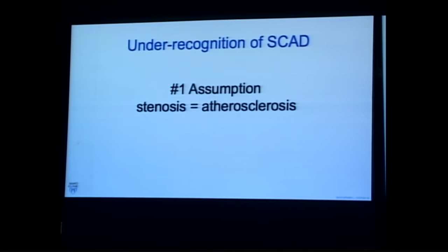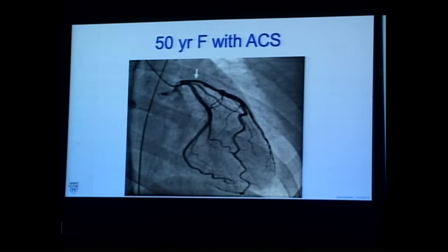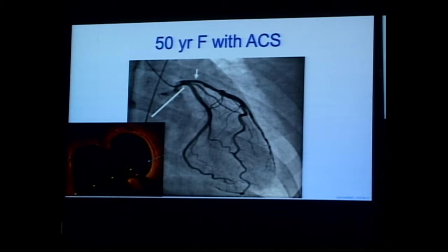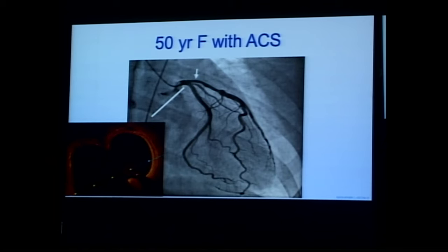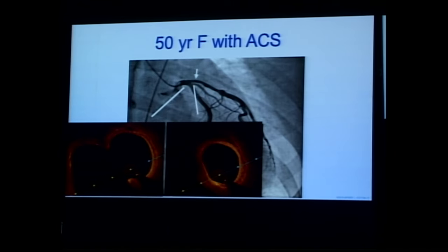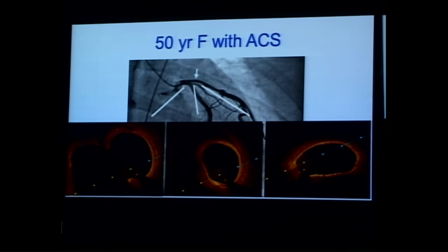One reason for under-recognition is we assume everything is atherosclerosis. Here's a 50-year-old female with an ACS — a few years ago we might have called this normal coronary arteries or minimal atherosclerosis. If you evaluate with OCT, you see at the left main bifurcation a tiny blip, which evolves over the next frames into a crescent, and then the whole vessel is surrounded by intramural hematoma causing a compressive, relatively minor narrowing. This is spontaneous dissection and intramural hematoma of the proximal LAD.